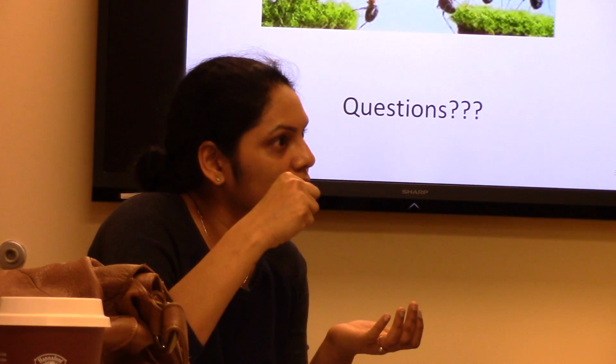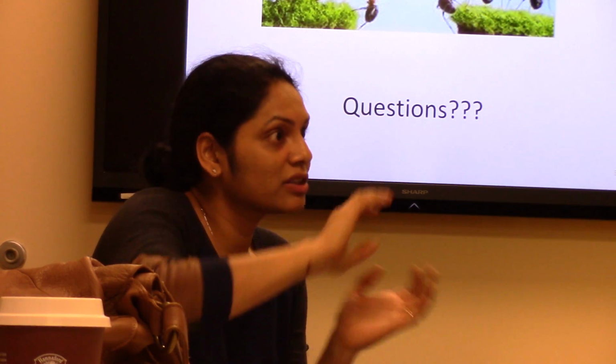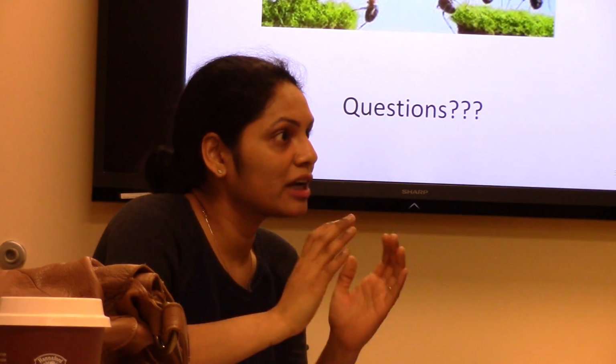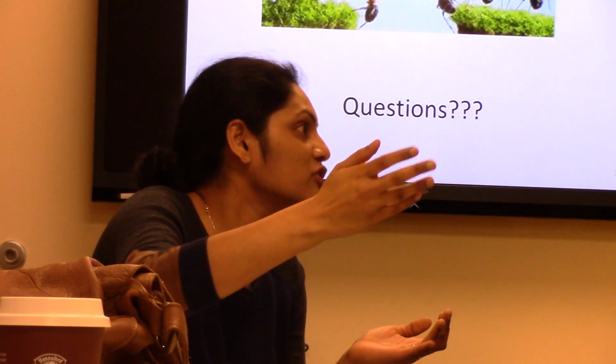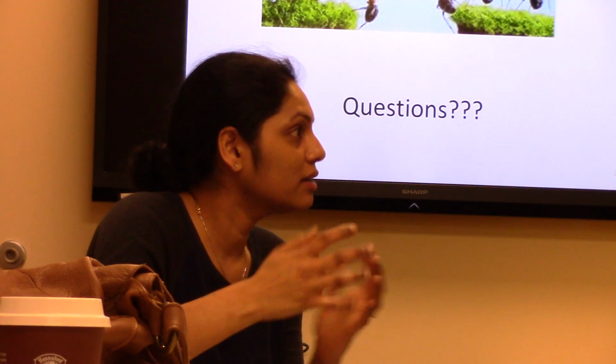But the valve can embolize. With the newer core valves, we can actually recapture them. If we think it's going to embolize, or if we think it's not in the right place, we can recapture and redeploy. So the technique again is changing. So it's getting better.